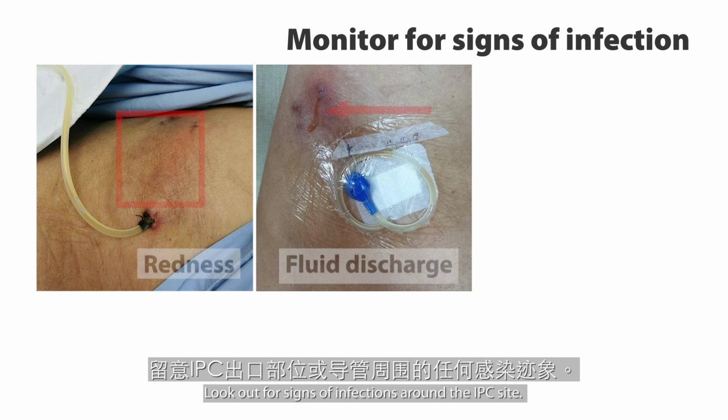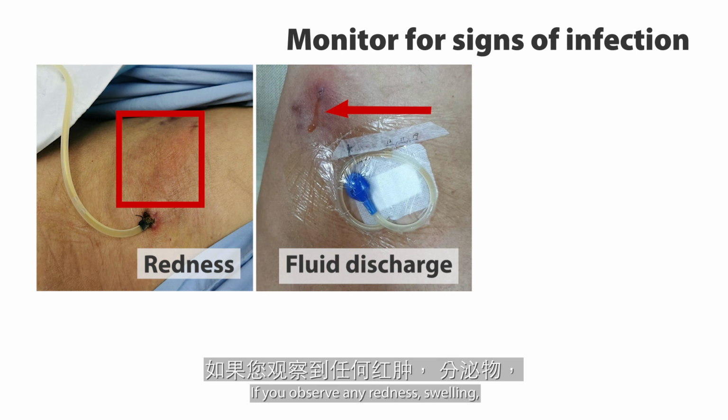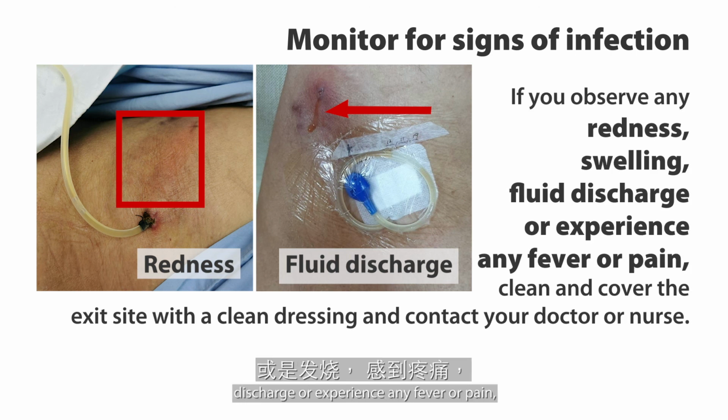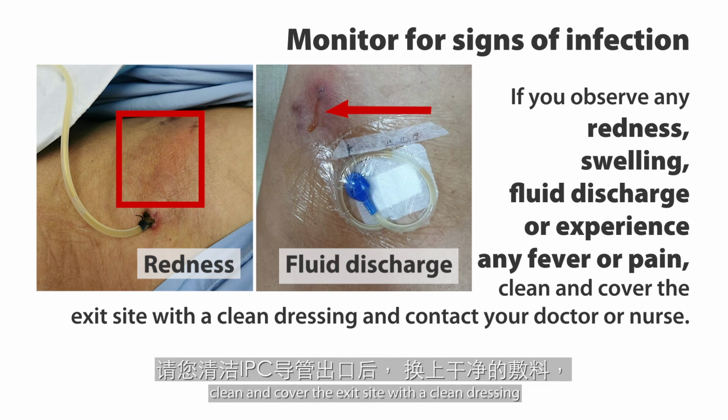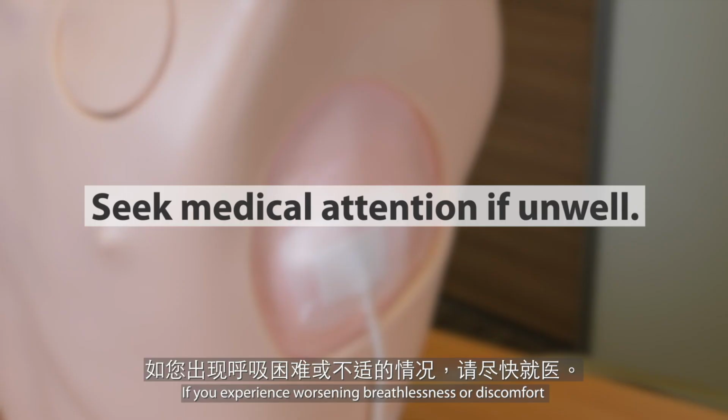Look out for signs of infection around the IPC site. The skin around the IPC site should be clean and look nearly normal. If you observe any redness, swelling, discharge, or experience any fever or pain, clean and cover the exit site with a clean dressing and contact your doctor or nurse. If you experience worsening breathlessness or discomfort despite fluid drainage, do seek medical attention.